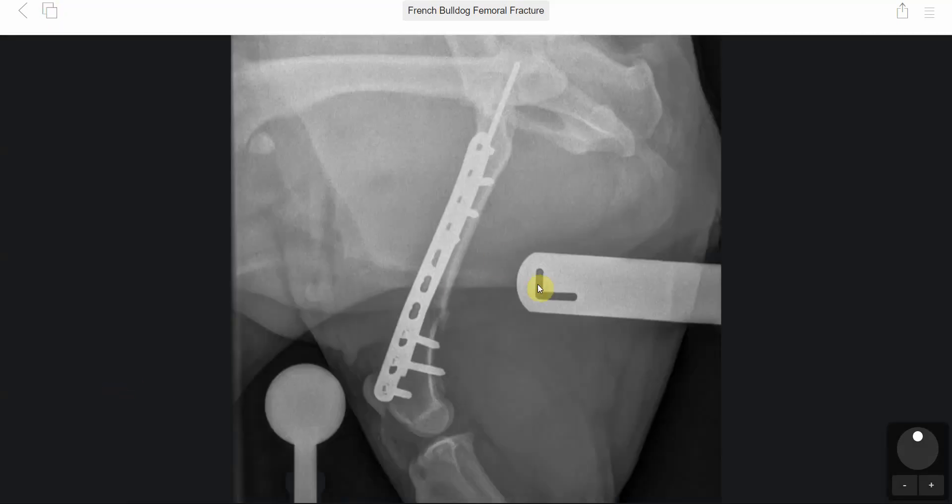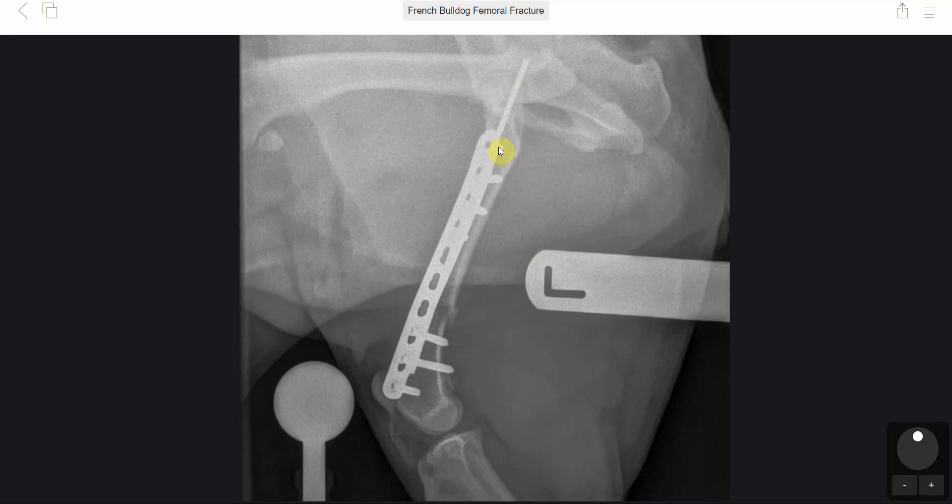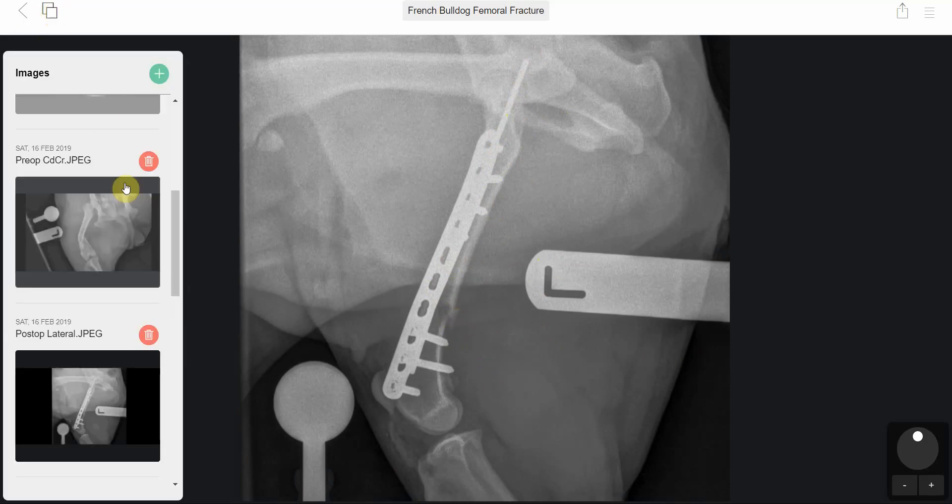Post-op, this is what we had. We had the intramedullary pin visible at the top and the 10-hole 2.7 LCP. These are all locking screws that we placed, with the small fragment of bone visible.